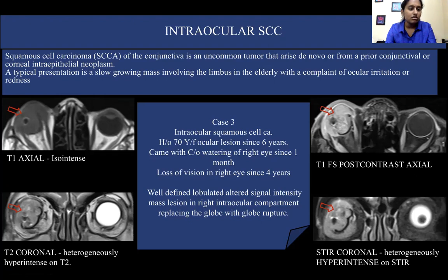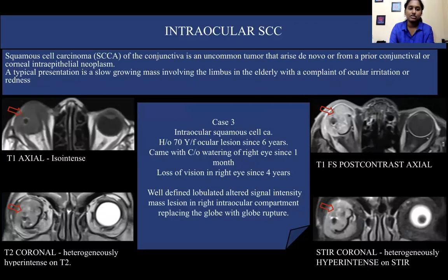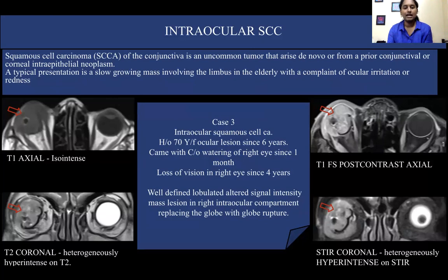A linear structure appearing hypo-intense on all sequences represents the margin of the ruptured globe. Squamous cell carcinoma of the conjunctiva is an uncommon tumor that arises either de novo or from a prior conjunctival or corneal intraepithelial neoplasm. A typical presentation is a slow-growing mass involving the limbus in the elderly with a complaint of ocular irritation or redness. Most commonly, squamous cell carcinoma would involve the eyelids, limbus region, or conjunctiva. Intraocular invasion is generally a rare condition, as seen in this case.